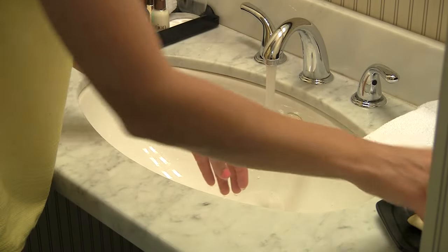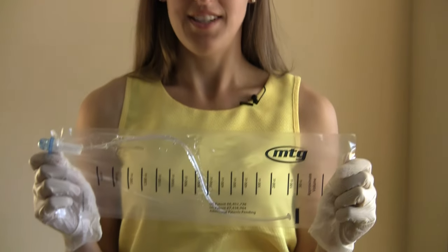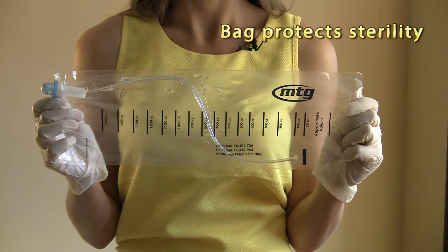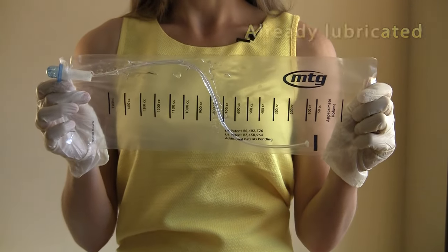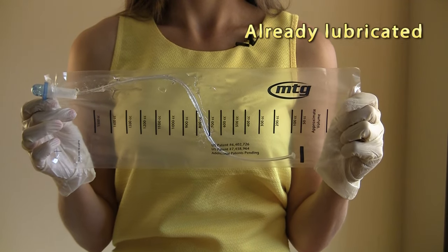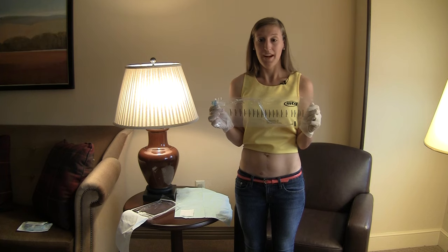The first step of the catheterization process is to wash your hands. This is my MTG catheter. As you can see the bag protects the sterility of the catheter and also will catch the drainage. It's already lubricated so that eliminates that step. You can use it in the car, you can use it in the bathroom, you can use it anywhere you have to go.